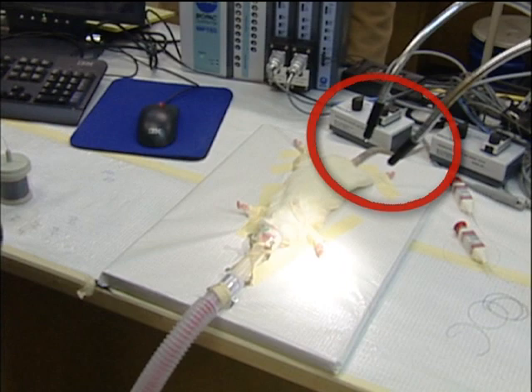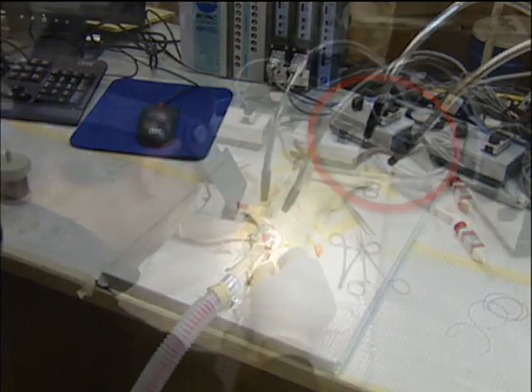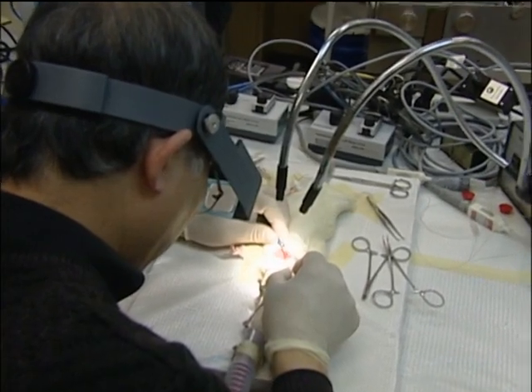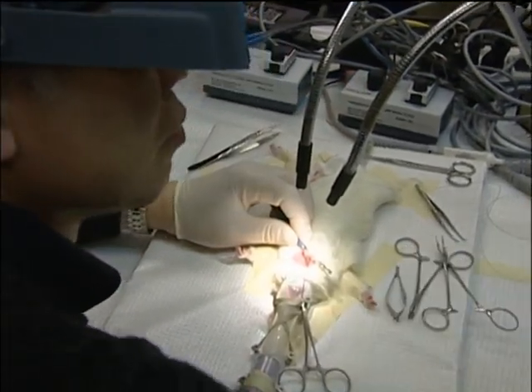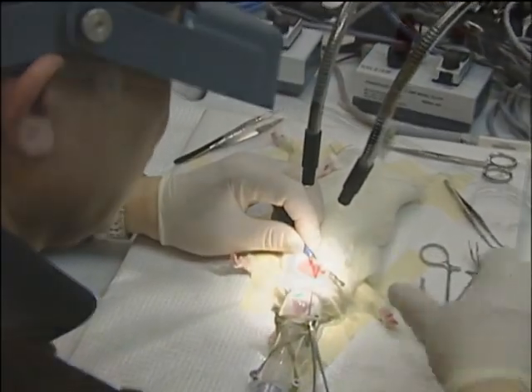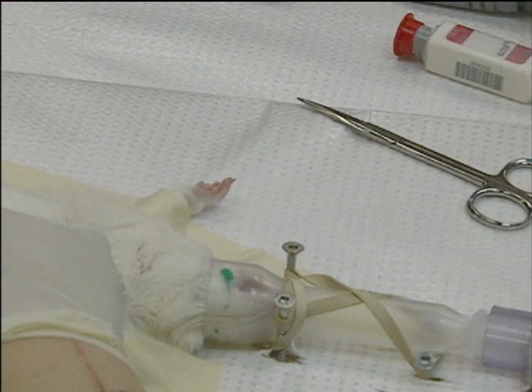This is the most important equipment, as the blood vessels of the rat are very small, making it difficult to cannulate. A magnifying glass is often needed to see the vessels better before they are cannulated. Oxygen and the anesthesia is administered to the rat through a breathing tube.